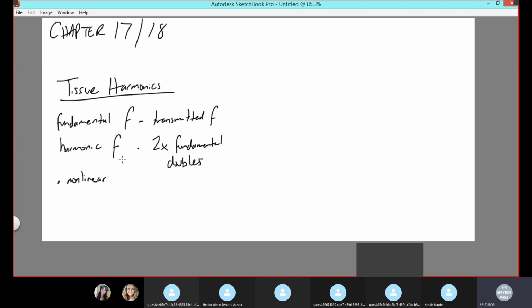So for tissue harmonics, it is nonlinear, it doubles your frequency, and it is created by these two guys, pulse inversion and power modulation. I'm not really sure if you have to know how each of these works.